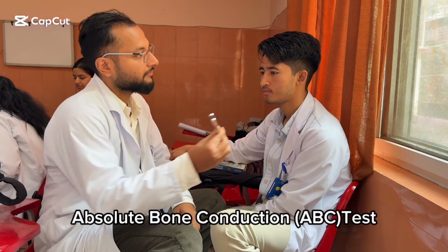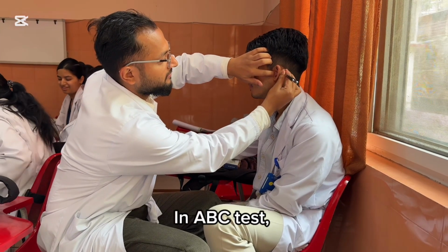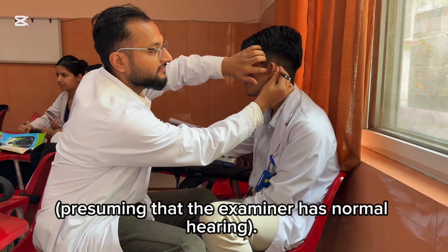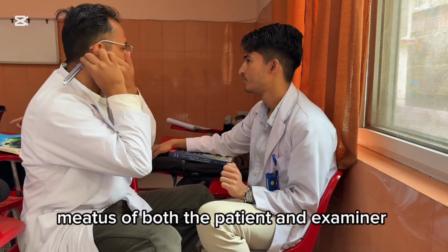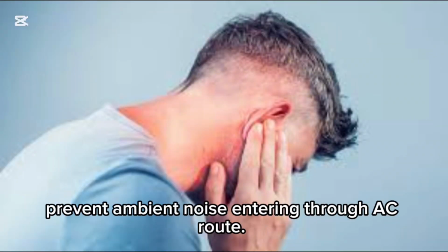Absolute bone conduction, ABC test. Bone conduction is a measure of cochlear function. In ABC test, patient's bone conduction is compared with that of the examiner, presuming that the examiner has normal hearing. External auditory meatus of both the patient and examiner should be occluded by pressing the tragus inwards to prevent ambient noise entering through AC route.